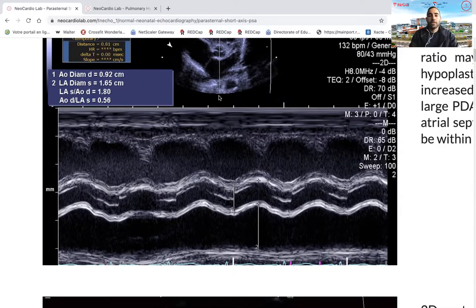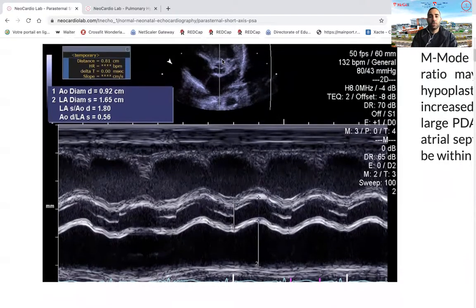Now, just a caveat, remember that a lot of newborns will also have some degree of interatrial shunt because their PFO might still be present. Because of that, some patients will unload the left atrium into the right atrium through a left-to-right shunt at the interatrial level. So the degree of left atrial dilation will depend on the amount of flow through the ductus arteriosus, leading to excessive pulmonary blood flow and eventually to excessive pulmonary venous return.